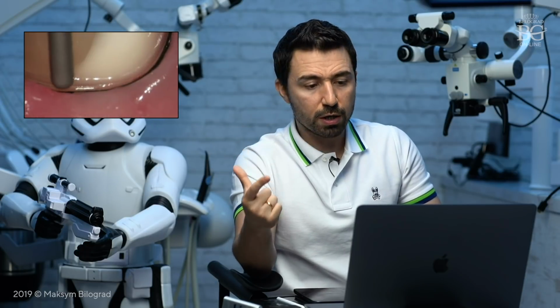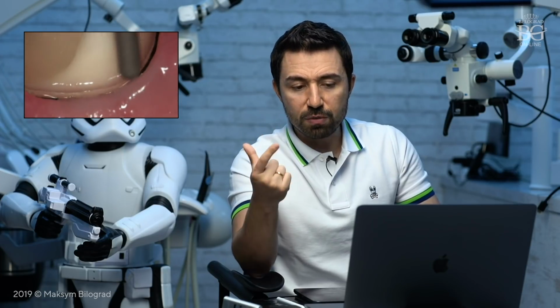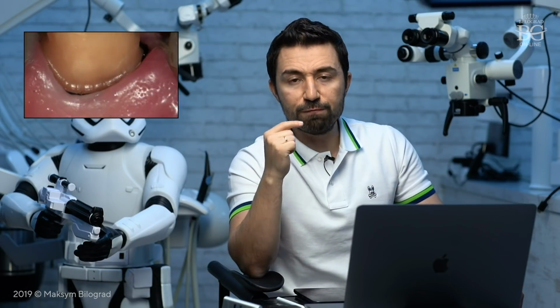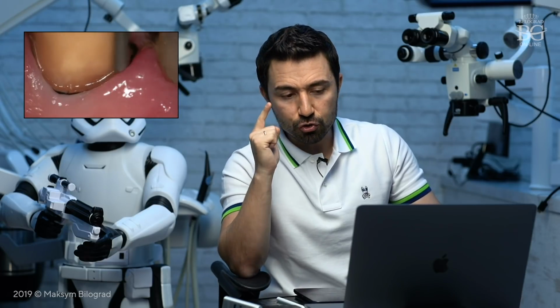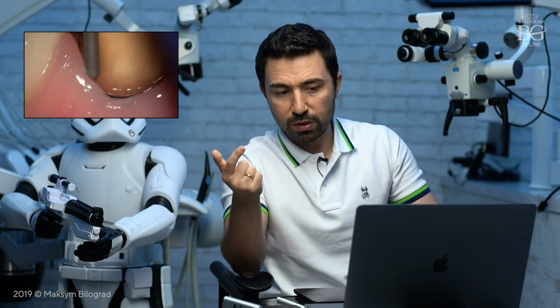Turbine will not work. Pneumatic motor will not work. Electric motor will work, because with an electric motor you can control speed, and speed in this case has to be really low. It's about 15-20,000 RPM. With that controlled continuous low speed, the helicopter effect will not be the same as with a turbine.